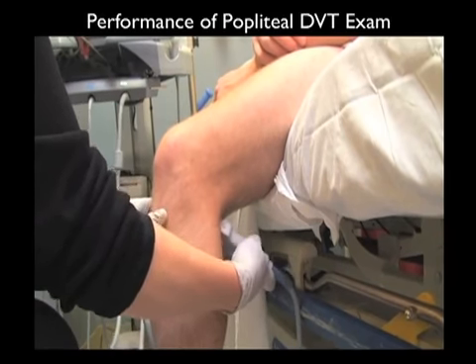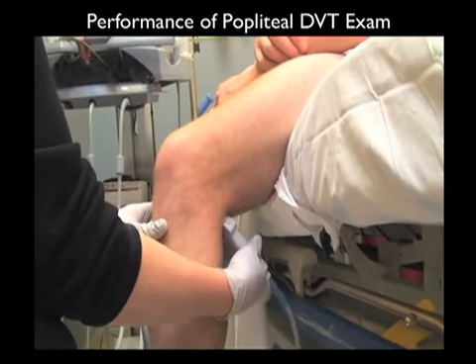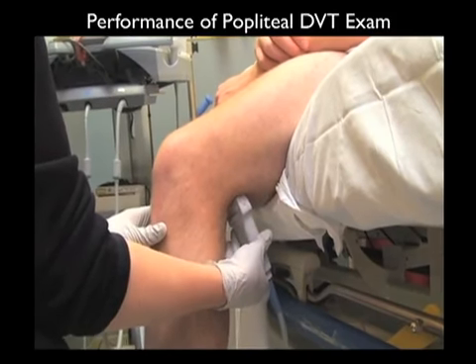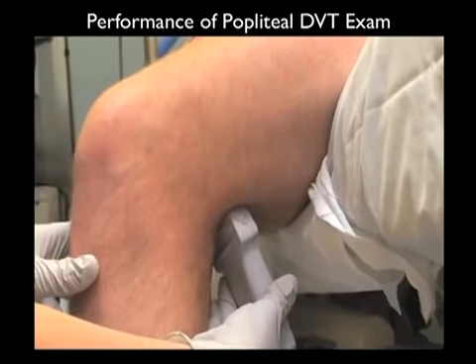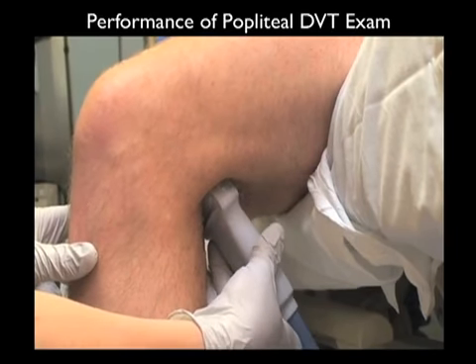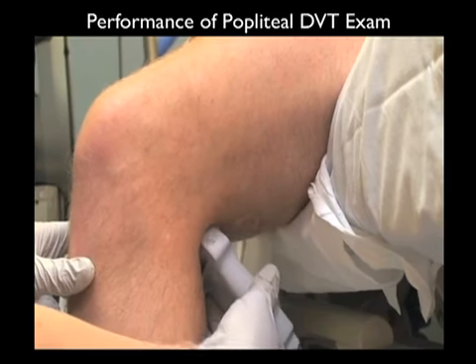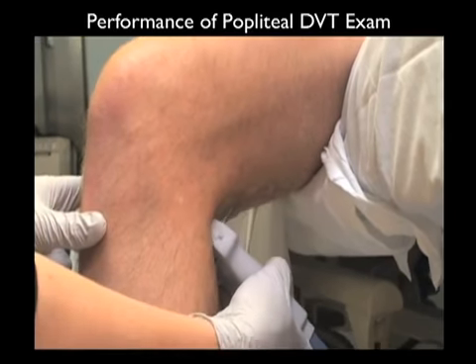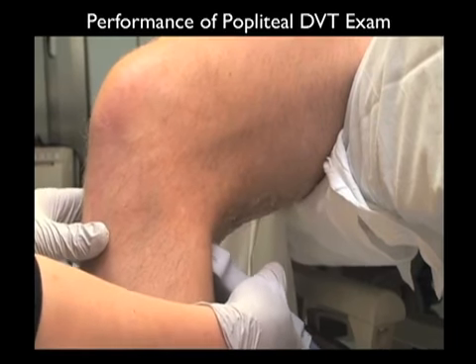We'll place the high-frequency linear array probe high within the popliteal fossa, sequentially compressing at levels all the way down to trifurcation. Notice that we're using our other hand to stabilize the anterior knee as we press with the probe posteriorly. So again, we'll start high within that popliteal fossa, compressing sequentially all the way through the levels of the popliteal artery and vein, down inferior there, all the way down to trifurcation.